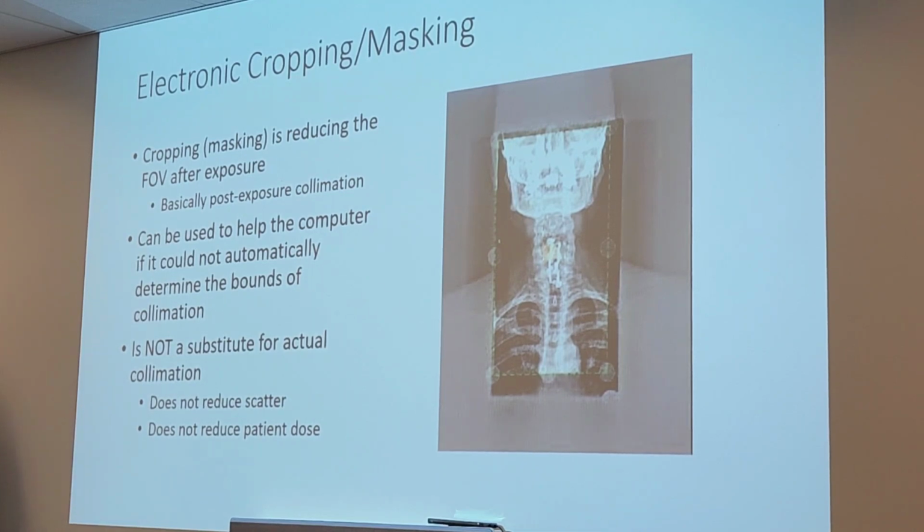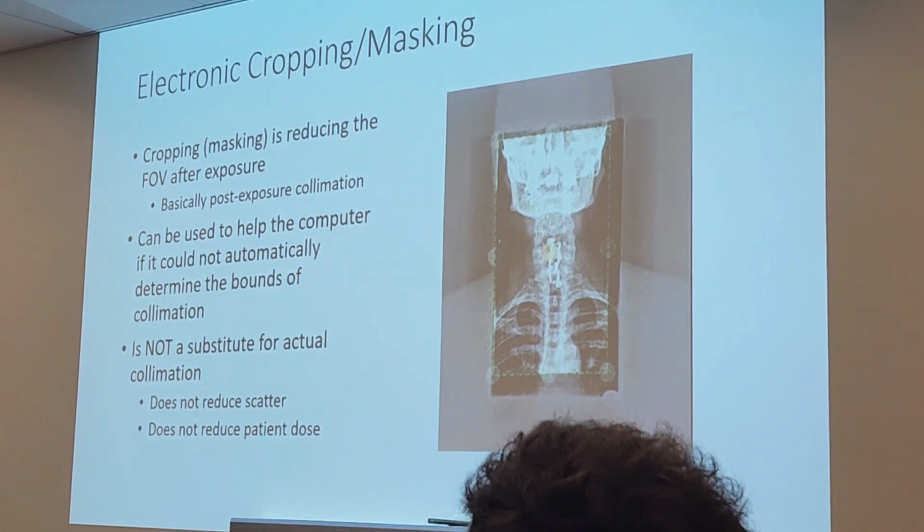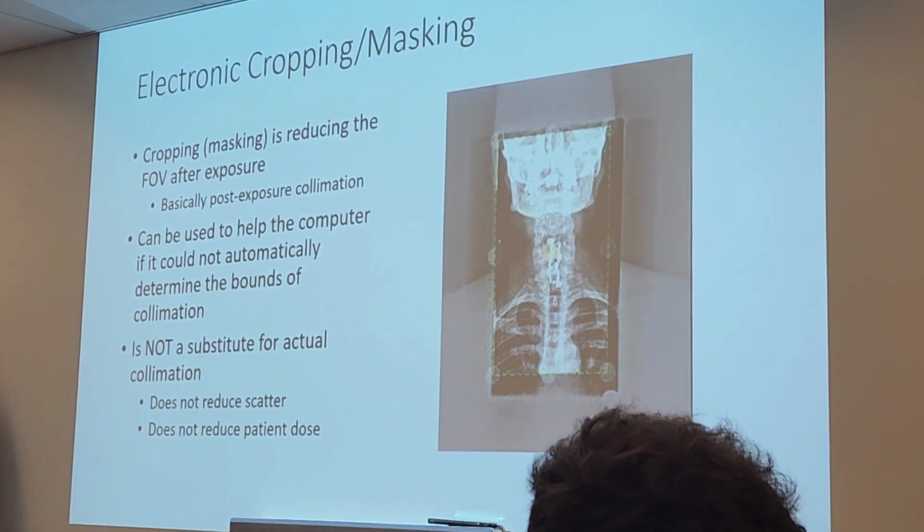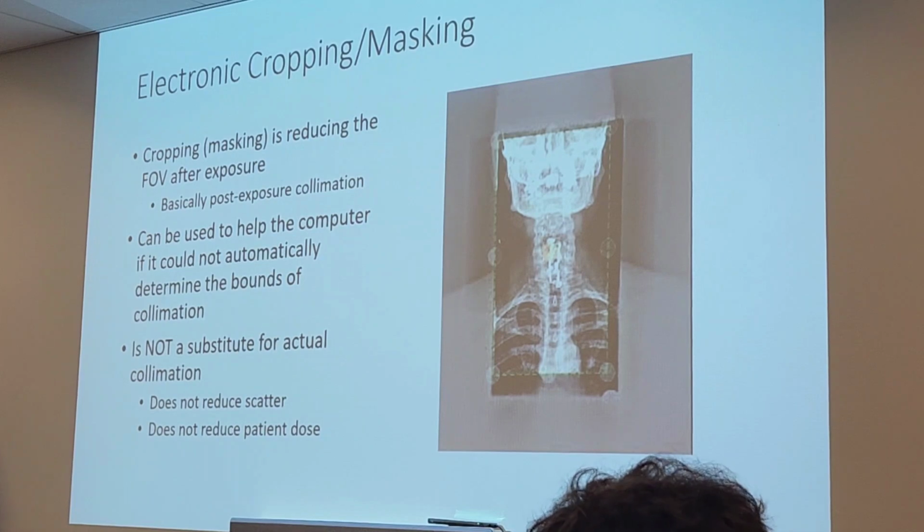So if you mess up and then fix it in post-processing, the evidence of the mess up is gone if you send it like that? Correct. For example, if you use the left marker on a right hand, and you think, oh no, I mismarked my patient, but I don't want to reshoot this x-ray, so let me be sneaky, crop out the marker, and put an electronic marker on with the correct side. Will they be able to pull up the old information? No, they won't. So yes, you have successfully hidden your mistakes.